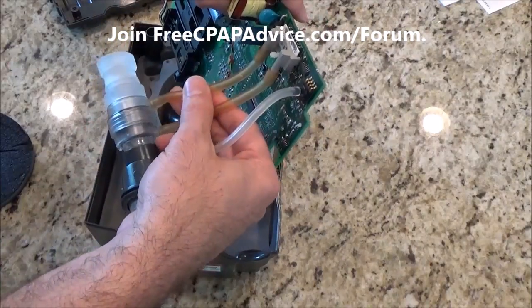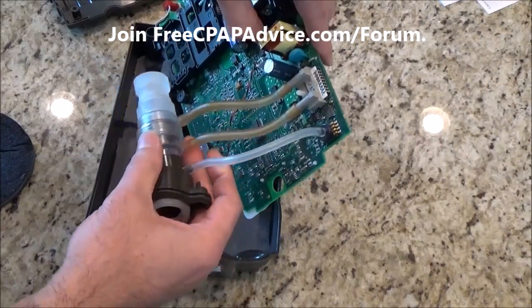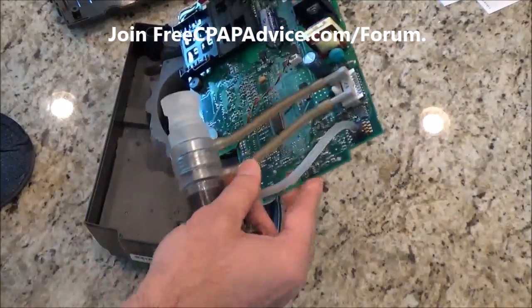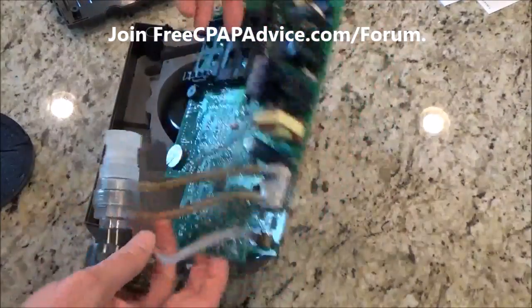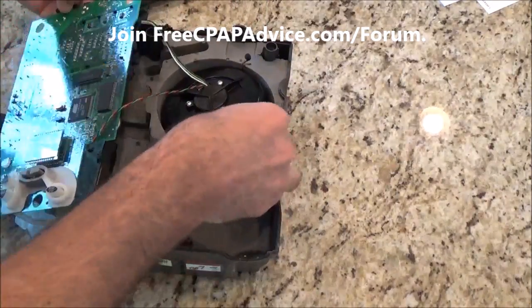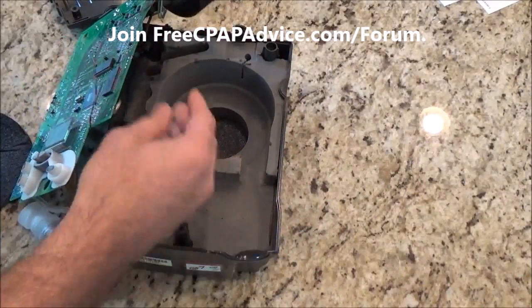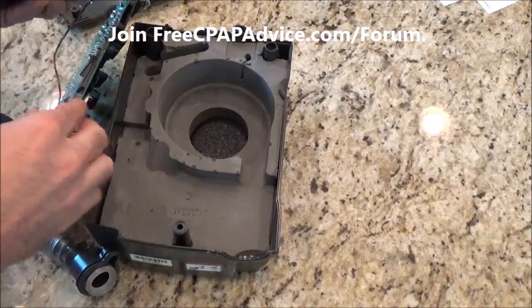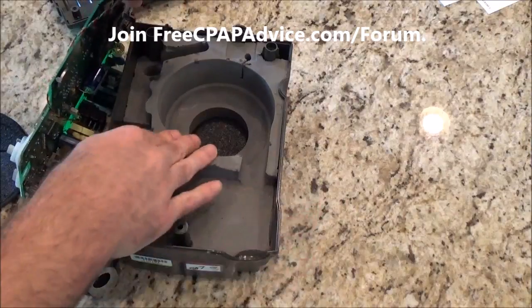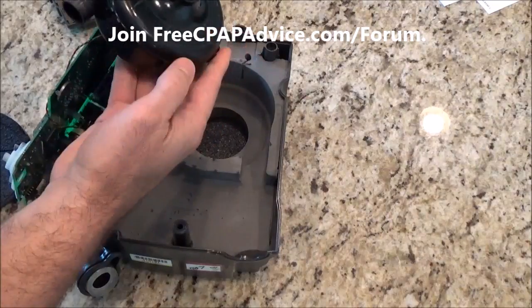We use a setup like this in the sleep lab. It gives the machine all sorts of data through a pressure transducer, and that is exactly what that looks like. Pretty cool. So if you ever want to make your own CPAP at home, it's not going to happen. No sir. It looks like most of it is just filled up with this foamy stuff. It reminds me of my science experiment in high school where you had to protect an egg inside something you built at home. Looks like they had that same project, and we're just protecting this little guy.